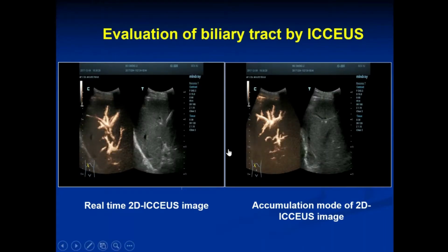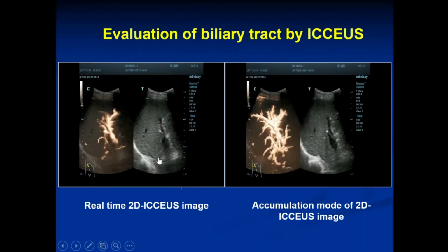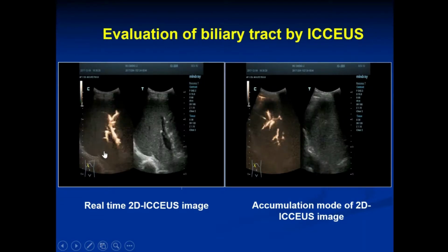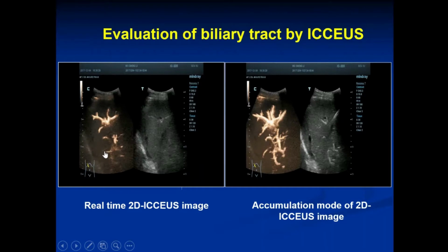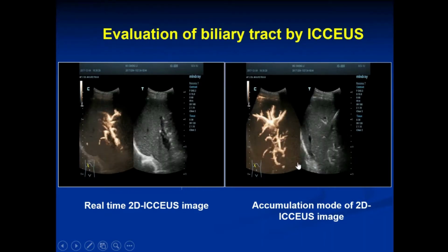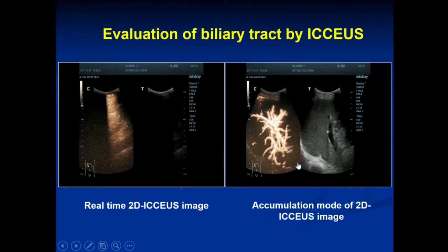This is real-time mode. It is easy for us to observe intrahepatic biliary tract and the branches dynamically. And this is the accumulation mode of 2D ICCEUS.